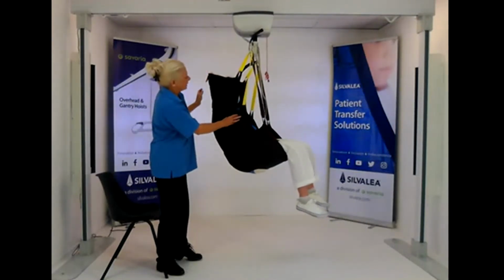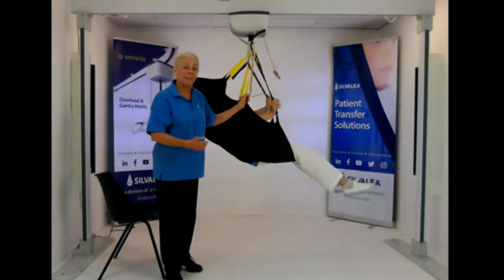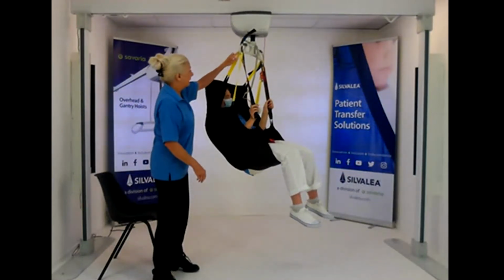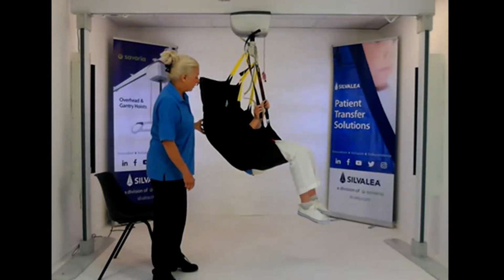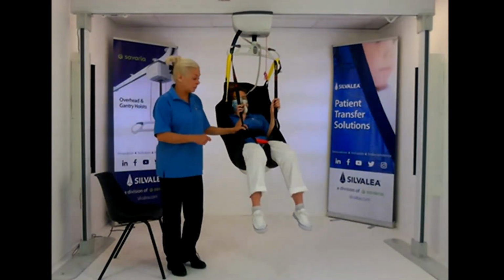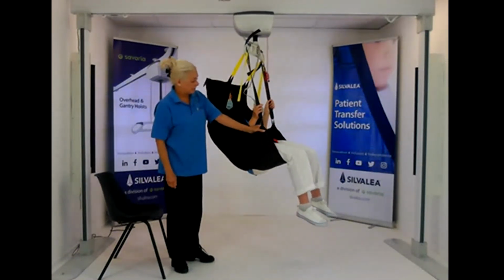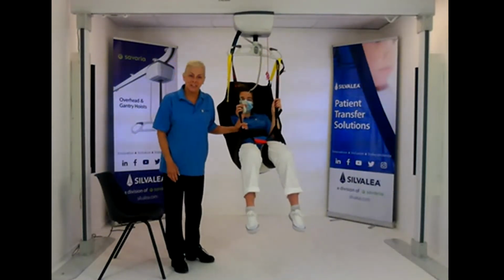So if Laura was to extend again, it will let the movement happen. It won't restrict her, but it will keep her contained within. And the counterbalance there, you can see it just flows over the top there. So quite a simple style for carers, because they've only got to fit the leg sections and then put this counterbalance on, as I said, but it will naturally give you a more reclined position.